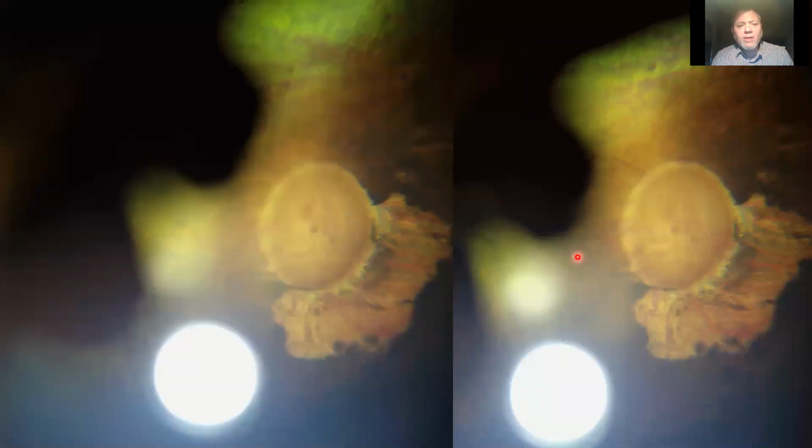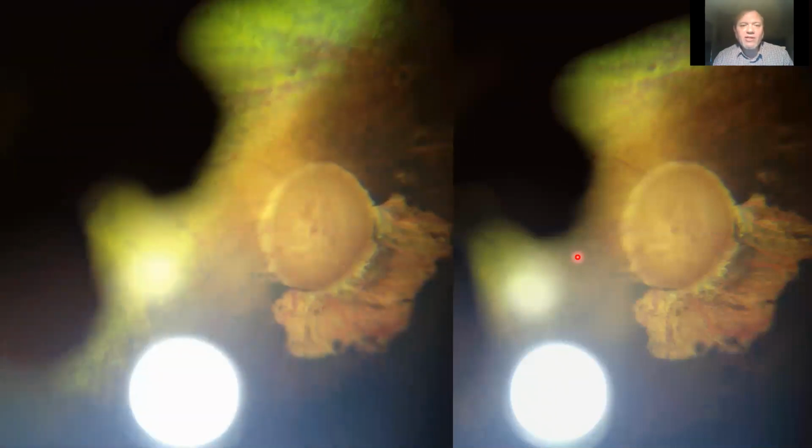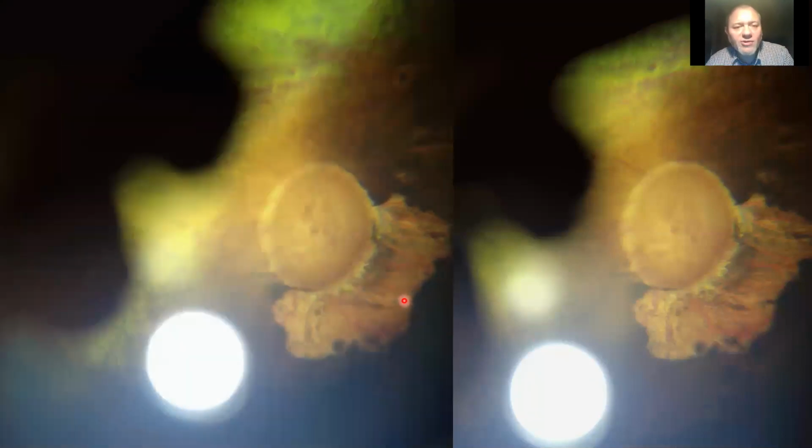This is another illustration of how multiple images can give us more subtle information. This is an older horse. It's got a butterfly lesion, an area of inactive chorioretinitis adjacent to its optic nerve head. The right-hand image shows that beautifully. What the left image shows us additionally is that this horse has got nuclear sclerosis.